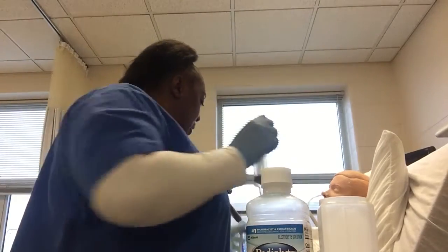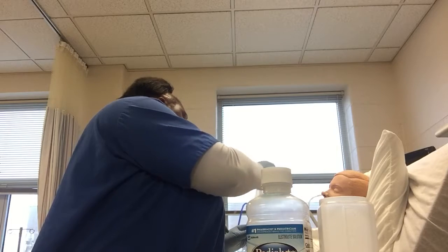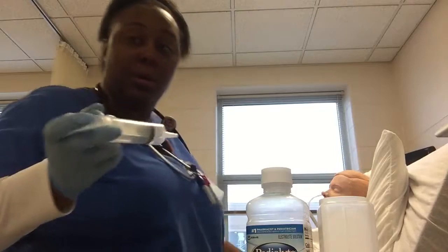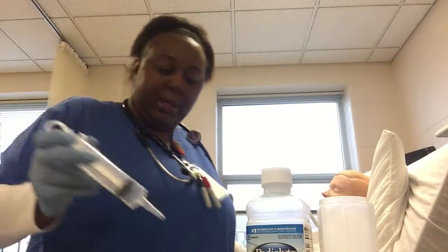And then I will get my syringe. I will draw some contents to test for the pH. Dab on the pH strip.